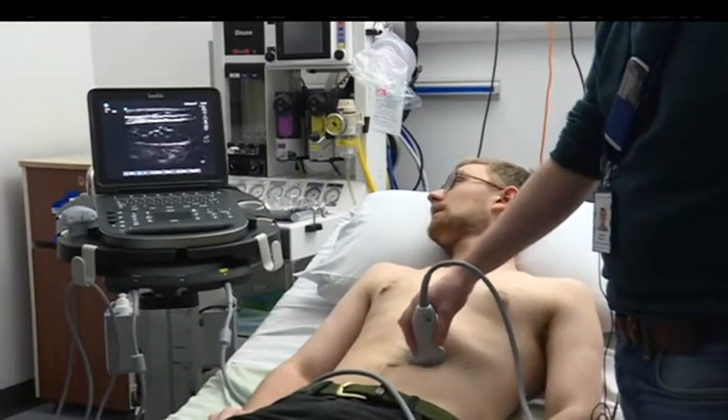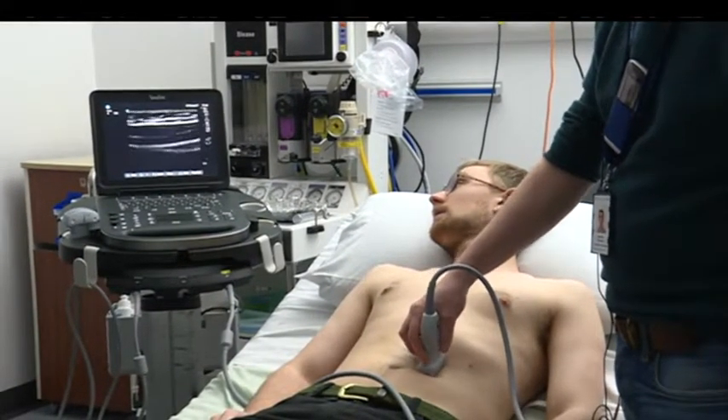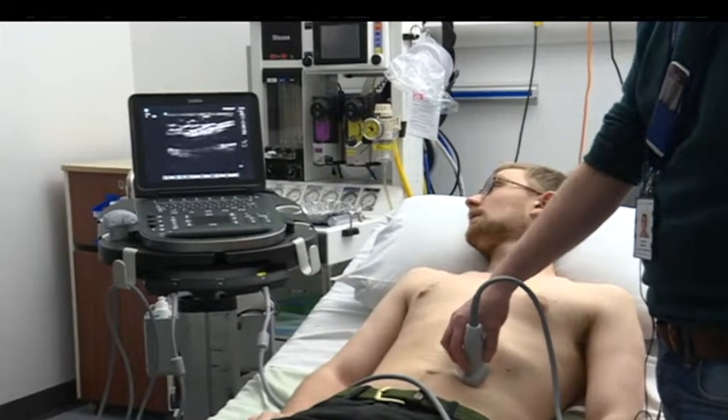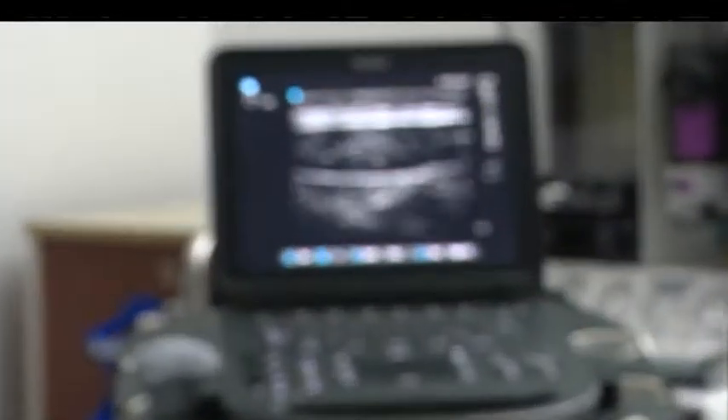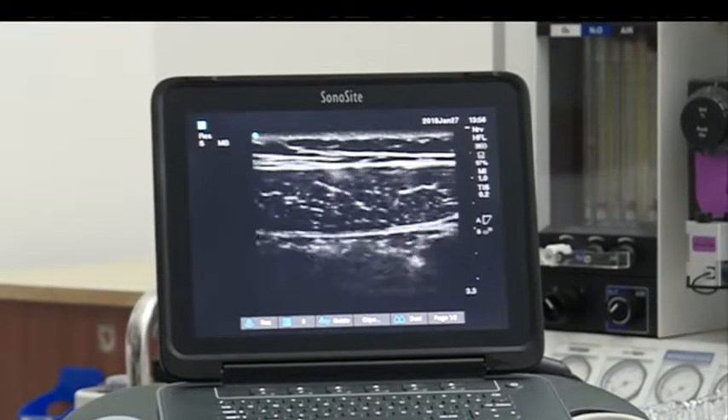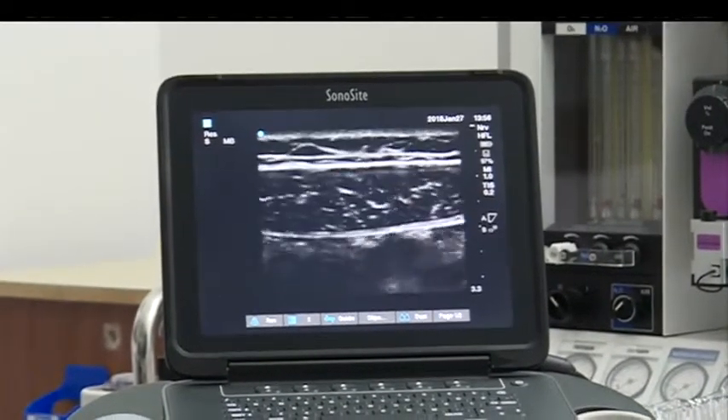There are two ways to do it: you can come in with the needle that way, or swing it around and come in like that. You can see the striae of the six-pack. The only thing to watch out for is a small blood vessel — the superior epigastric artery — somewhere in there. You get good spread, so you only need to do one on either side.